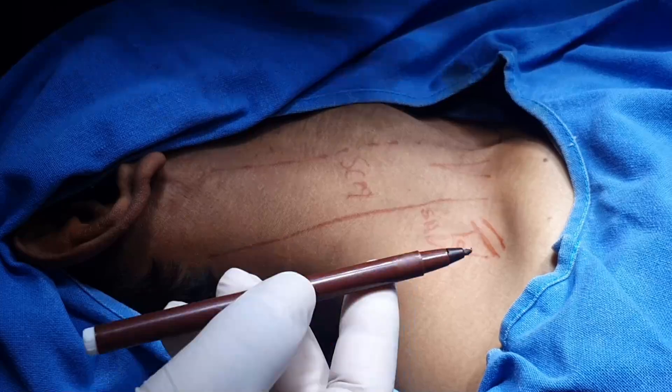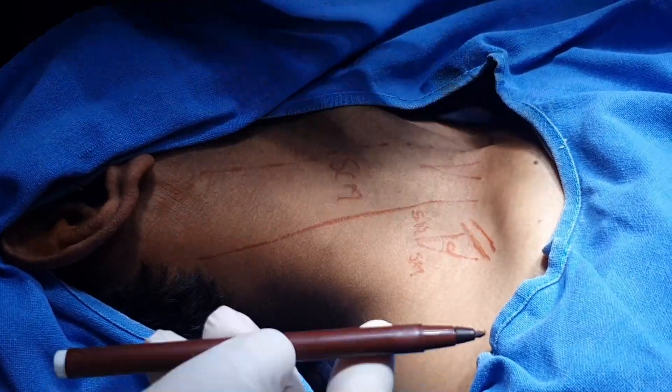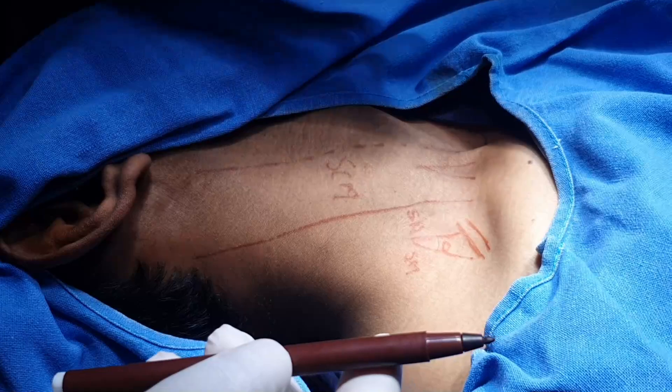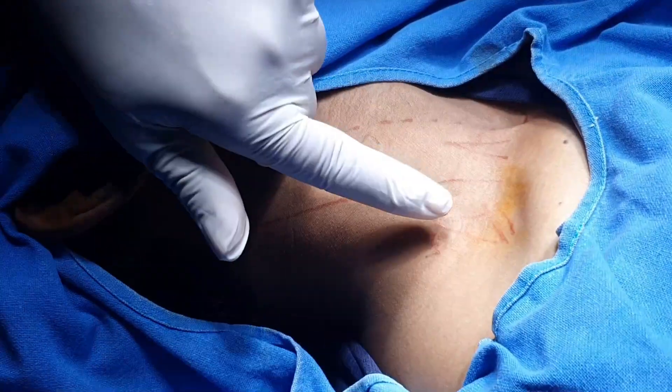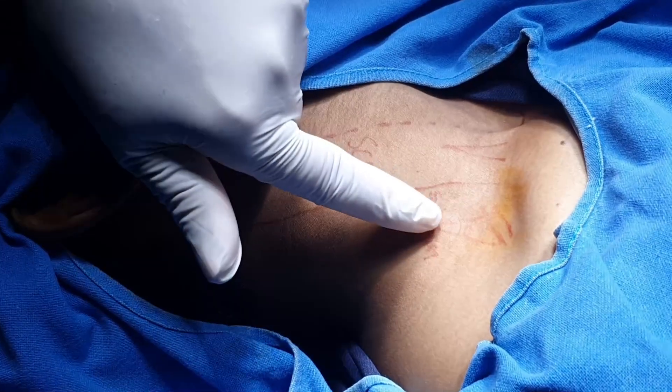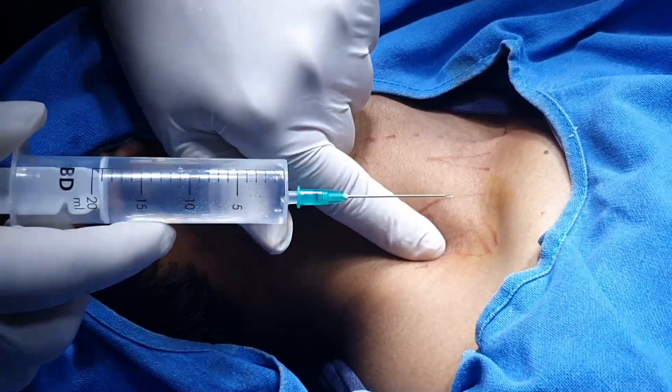We never try to elicit paresthesia — accidentally it may happen, but initially our purpose is not to elicit paresthesia by touching the nerves of the brachial plexus. Just put the finger in the interscalene cleft and insert the needle.